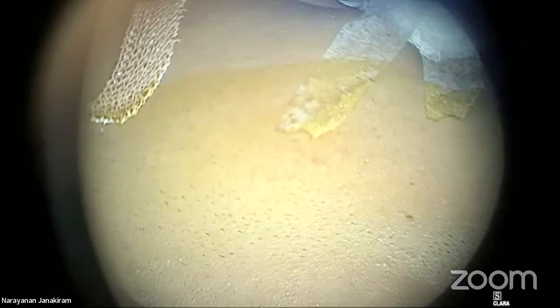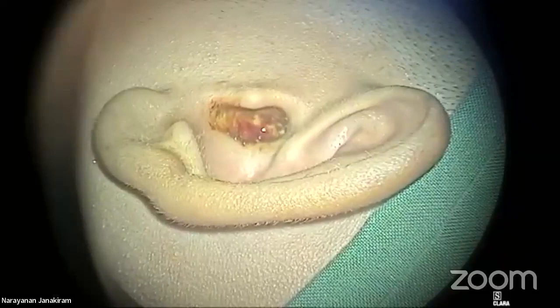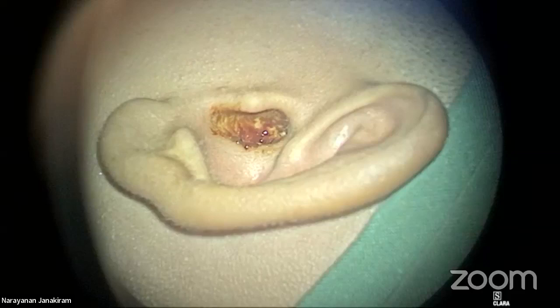From the incision, you just note the time. Take off my glasses. Okay, now this is the ear. You can see that very clearly. Just want to slight fake focus. Okay, infiltration. So I'm going to give infiltration 10-10-10 solution.